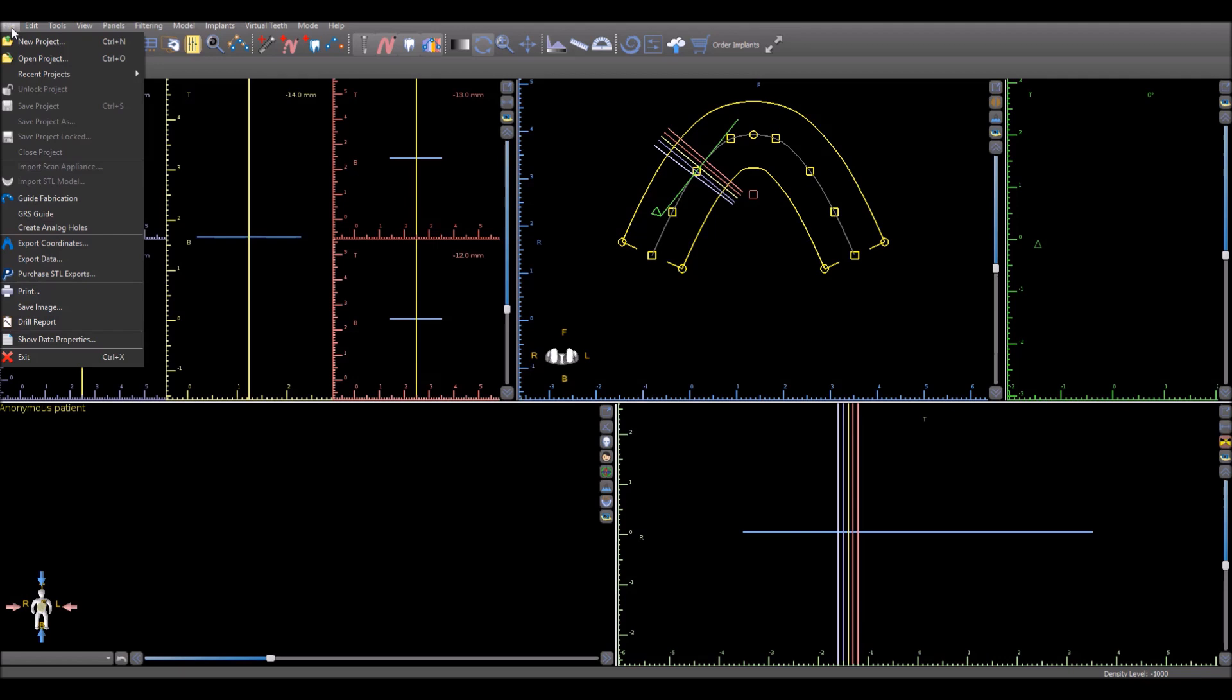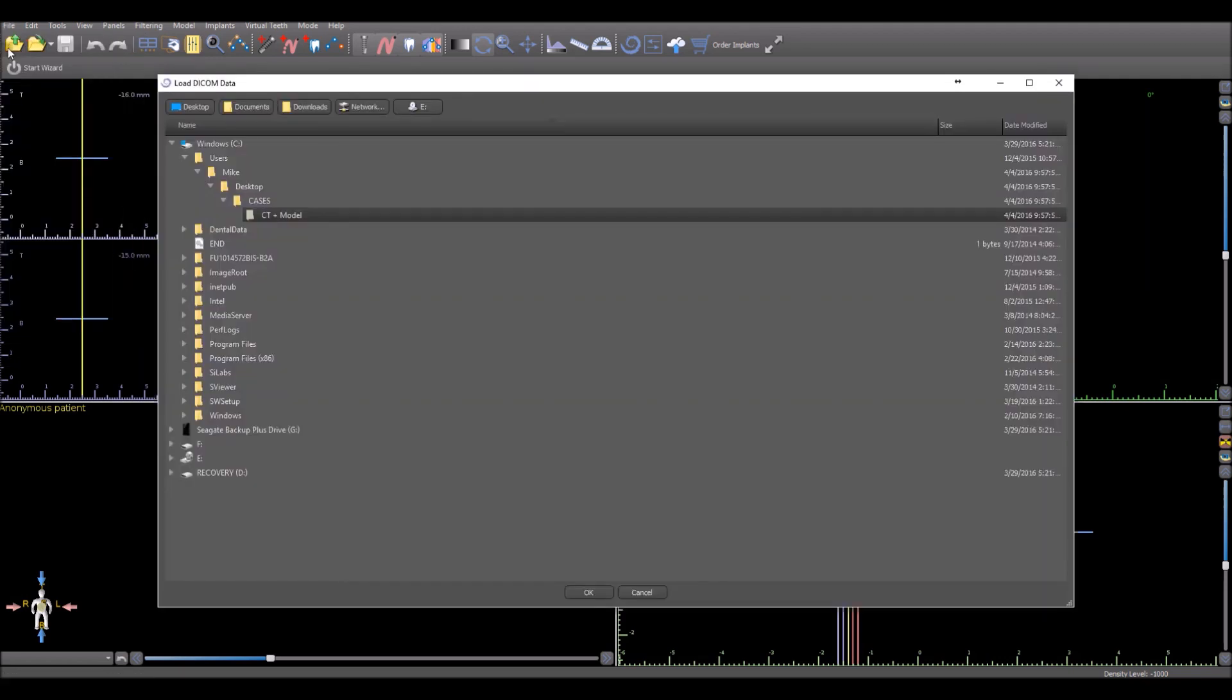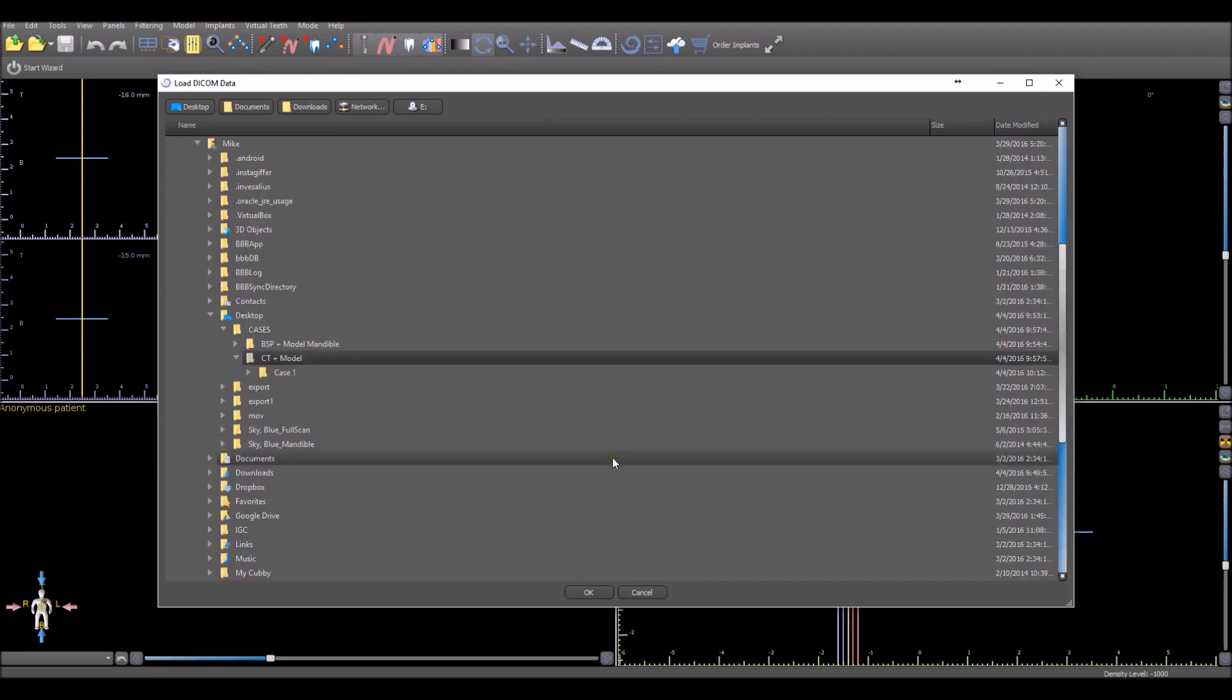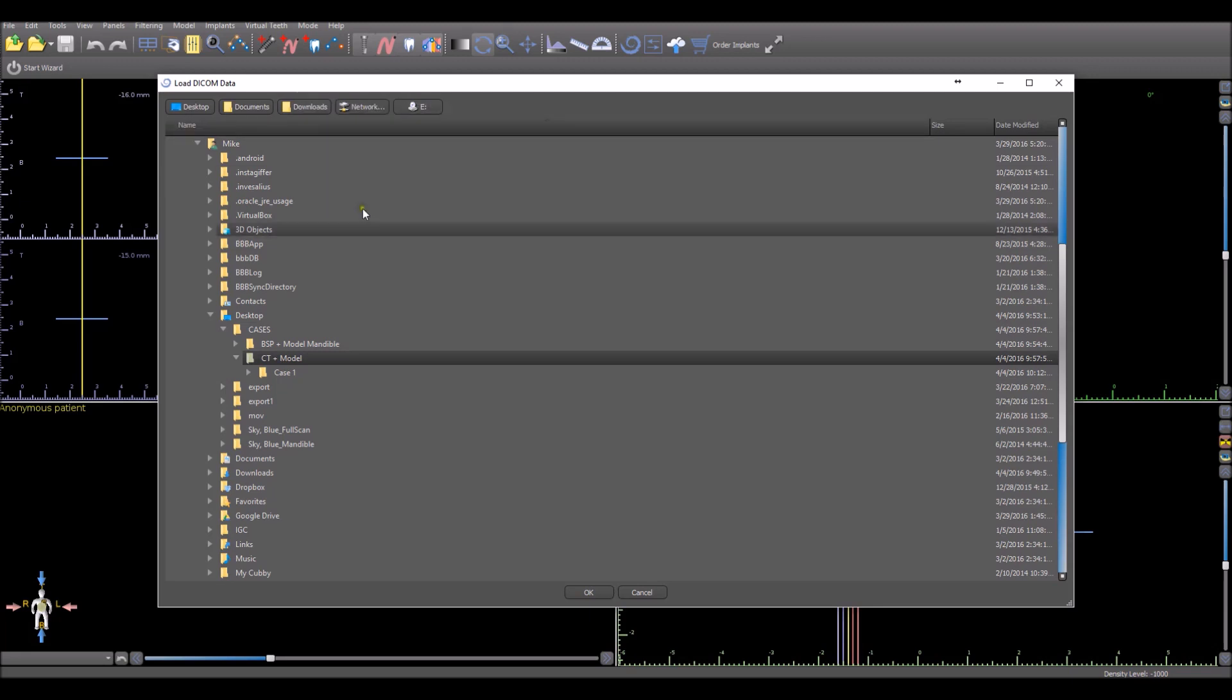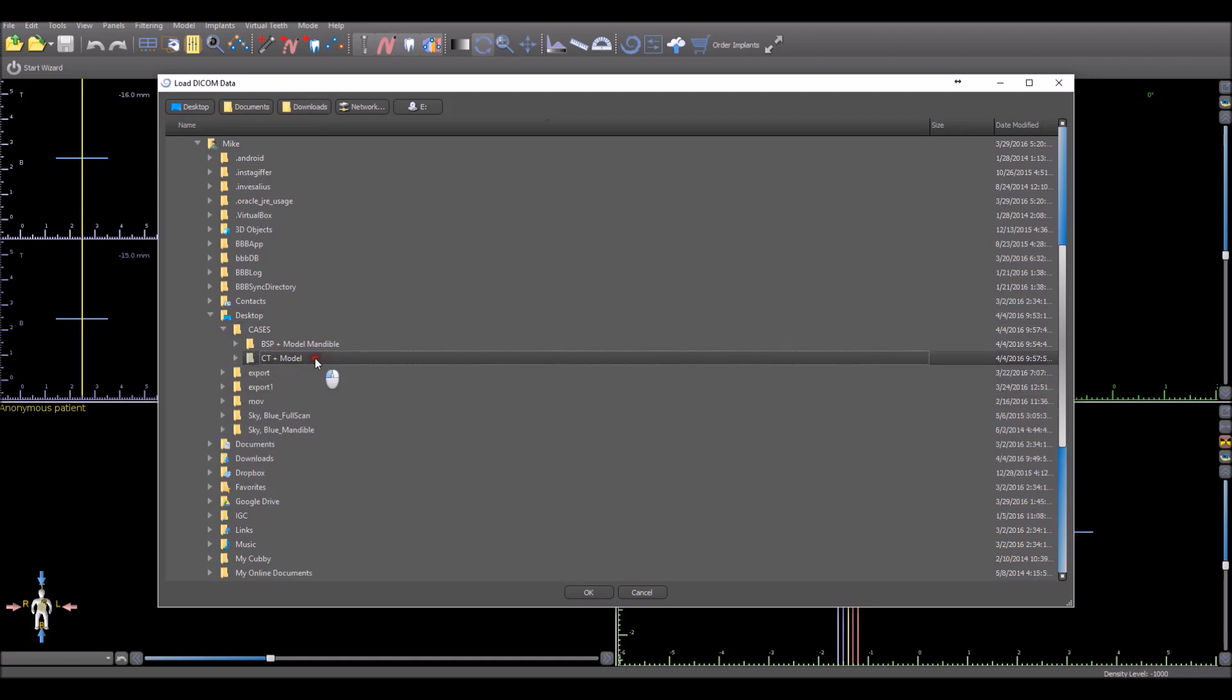Loading a new set of DICOMs is simple from File, New Project. You want to navigate to the DICOM folder that's containing the DICOM images. There are some shortcuts on top that you could use to navigate to the relevant location. The software will also search the sub-directories of whatever you select.